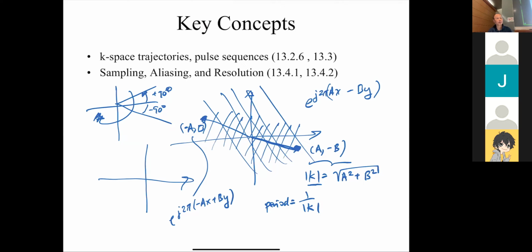But when we visualize from the image space, would that look the same? If you took the magnitude, yes. But if you looked at the phase, then it would be different. In general, we haven't spent too much time on that. In general, you look at magnitude images, so we just look at the magnitude, and it would appear the same from a magnitude point of view to first order.